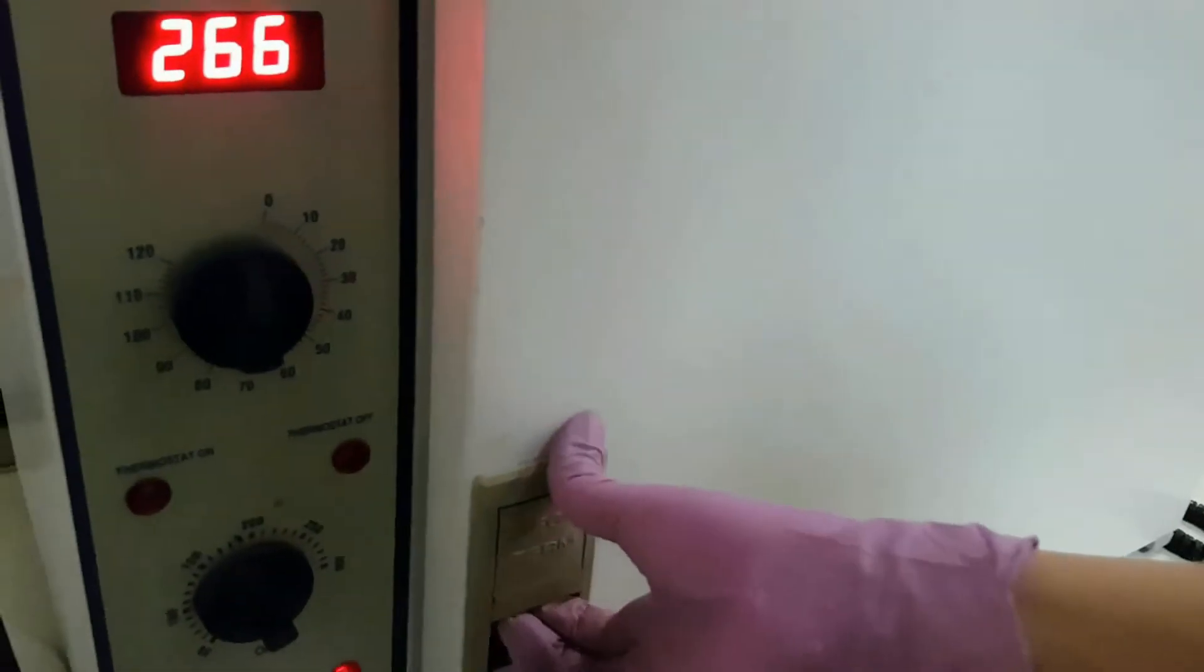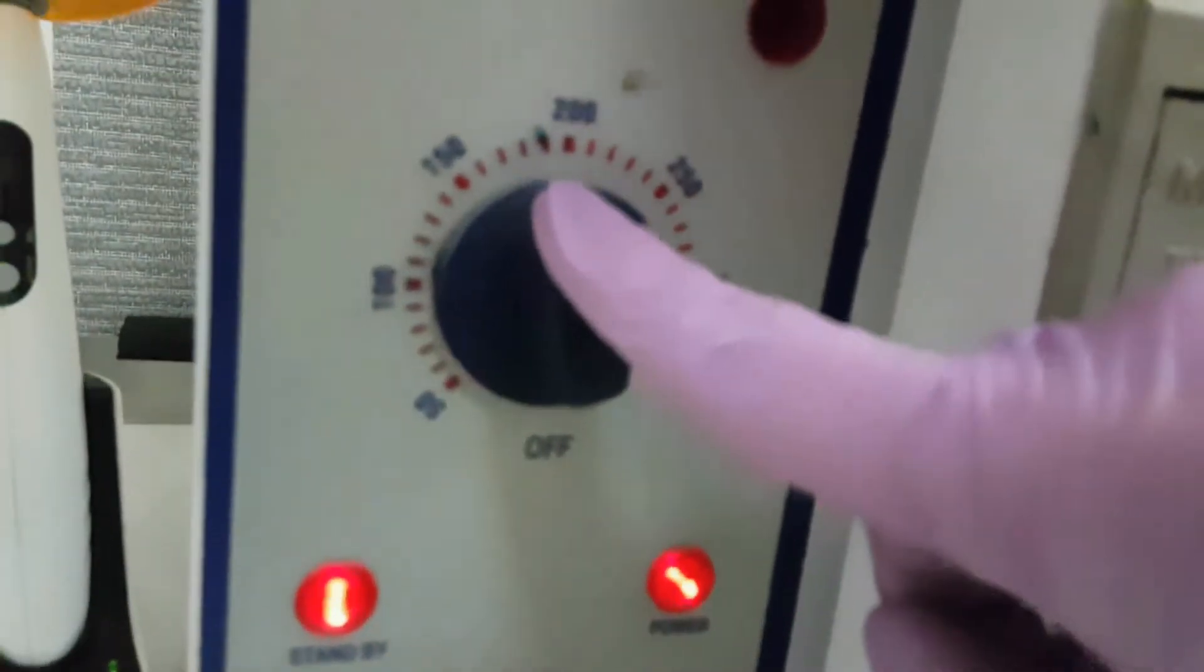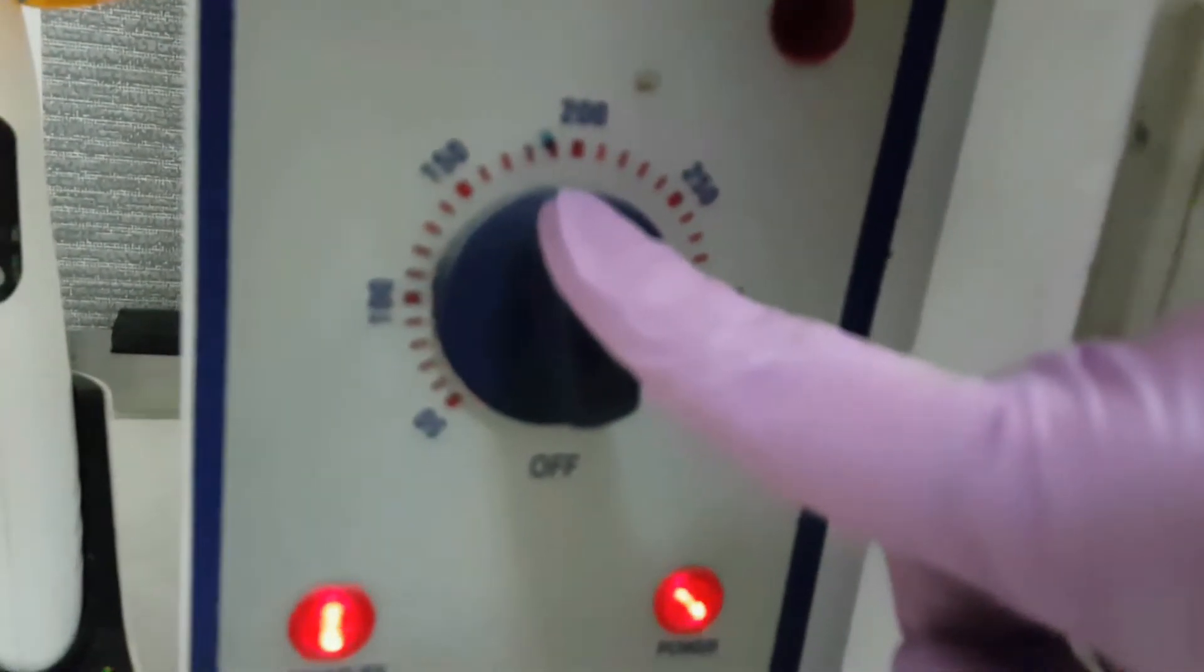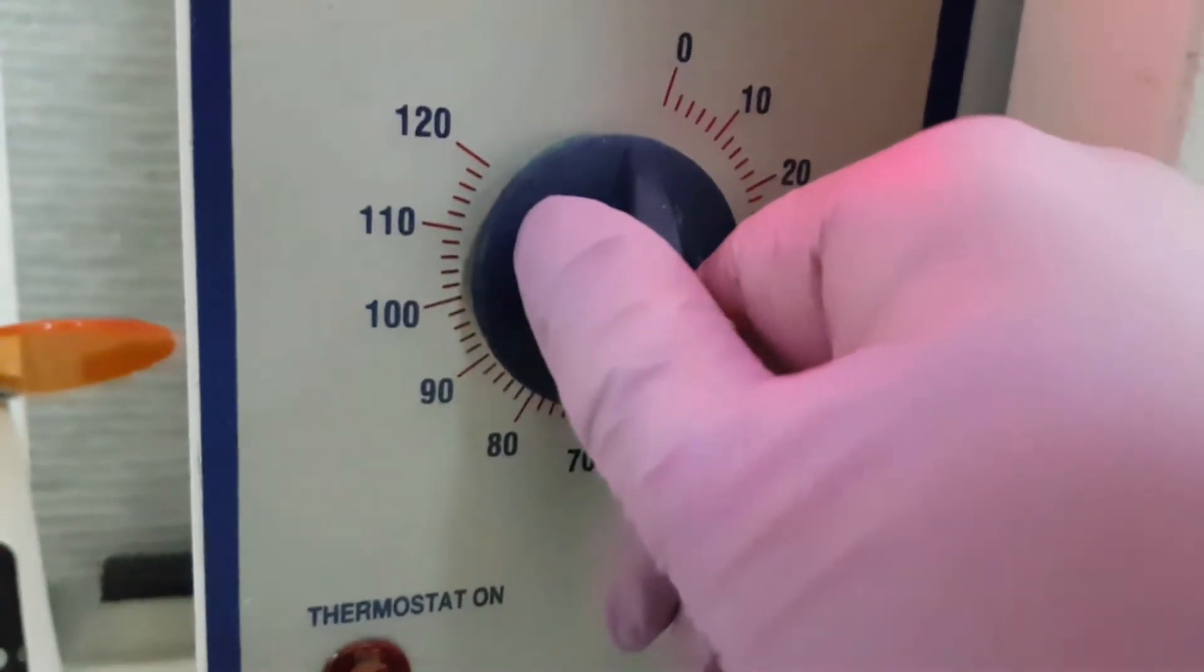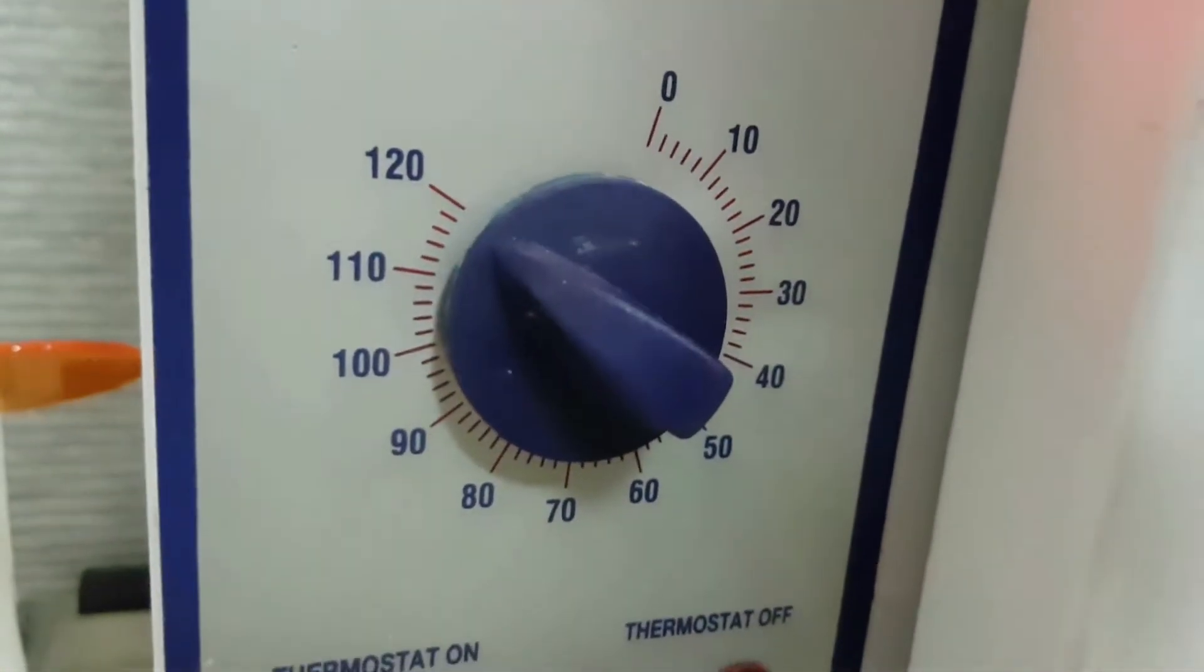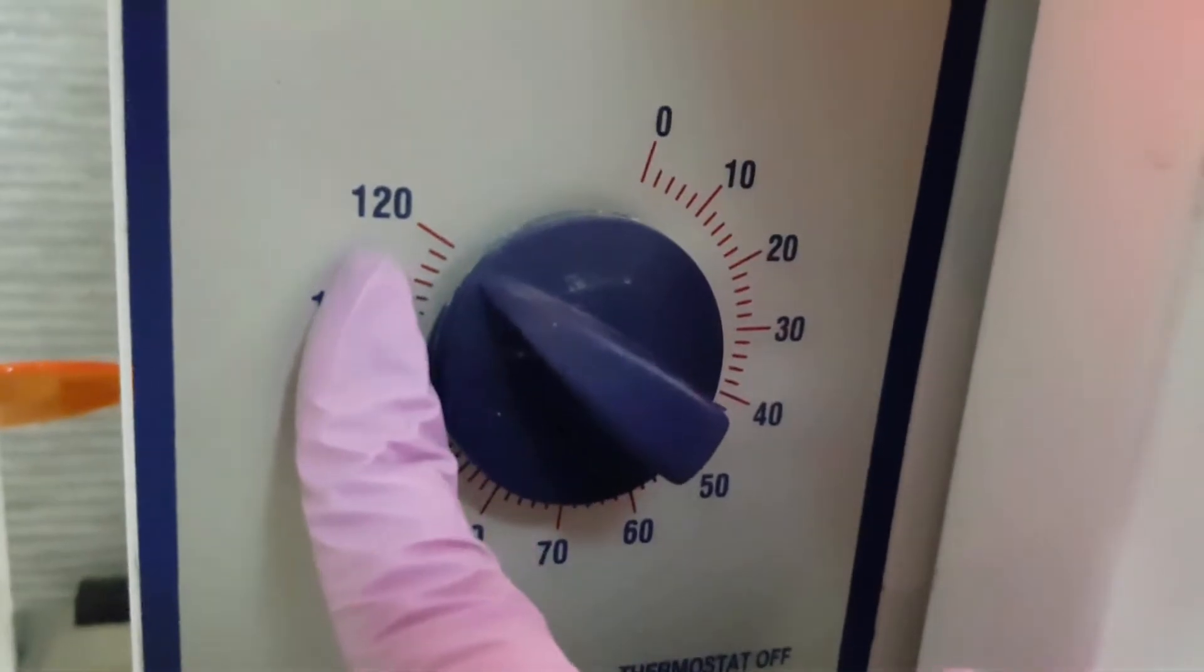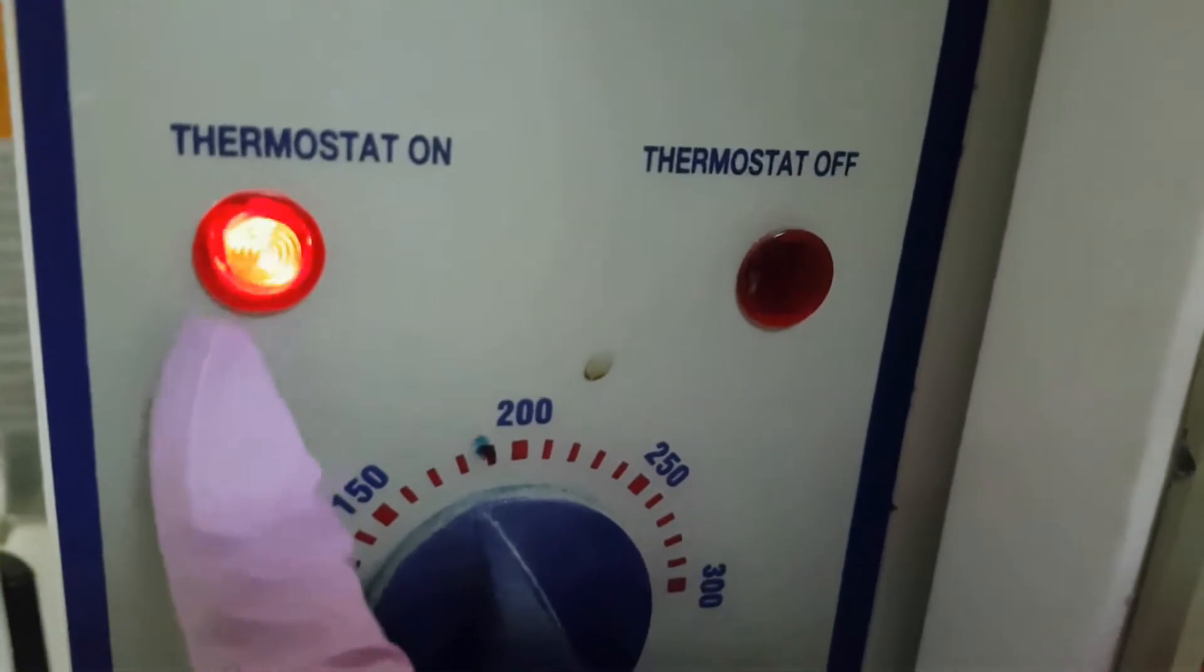So we close it up. We select our temperature 180 degrees Celsius and we put the timer on 120 minutes or 2 hours. This way we have maximum sterilization, and the light shows us that the machine is working.